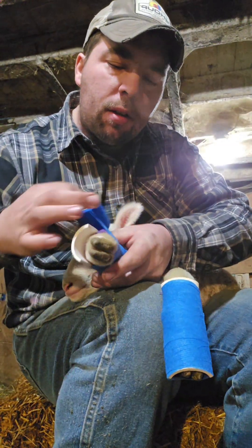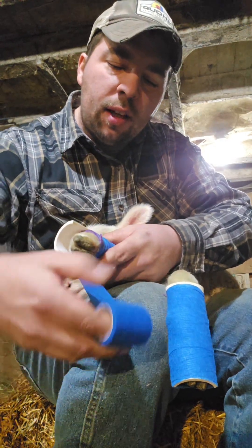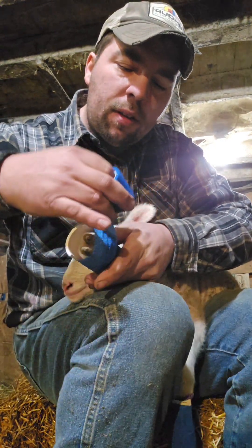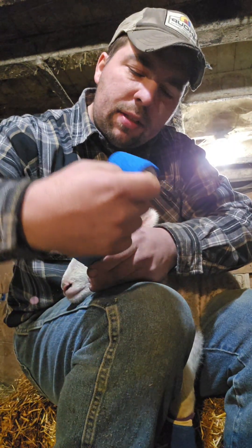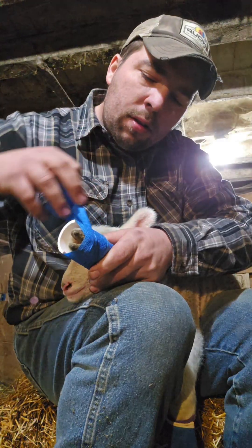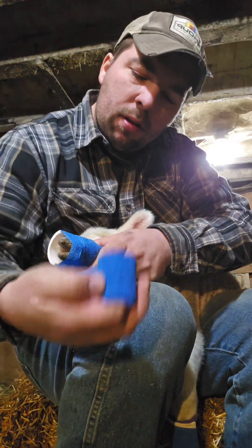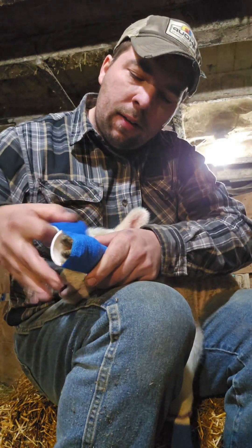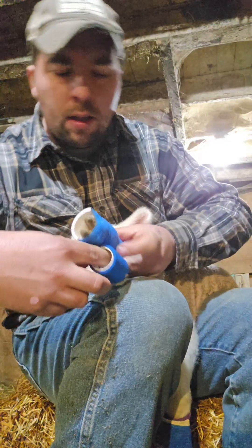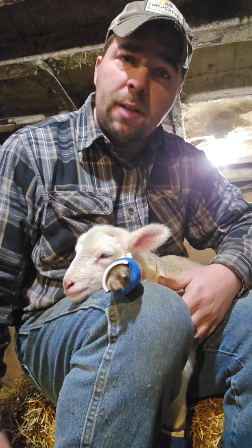So we're going to come around, maintaining a little bit of tension when we get to that hoof — that's where we pull a little bit. We're going to twist, put the weight where we want it, put a little bit of tension on there, and then just tie it all up. And we're done.